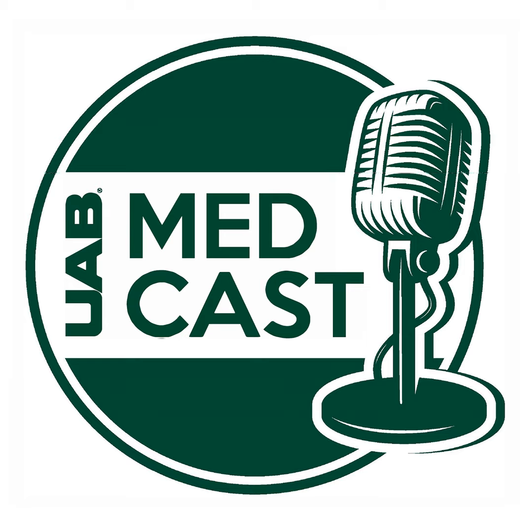Dr. Ponto, along those lines, why don't you speak a little bit more about that planning and how these implants are made? What happens is, for the workflow, patients come in for a consultation, and if they are an appropriate candidate, we can take a CT scan with some guides in their mouth that Dr. Case makes. The scan is reviewed by Dr. Case, myself, and an engineer, and we plan this implant based on the patient's anatomy.